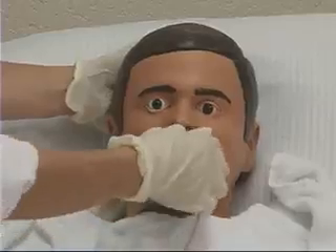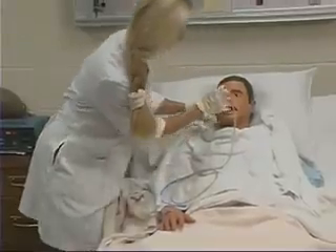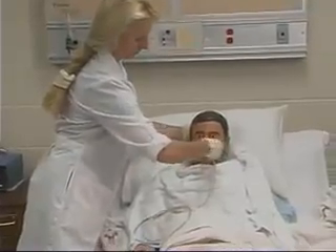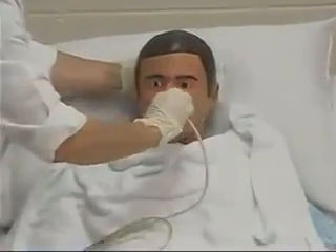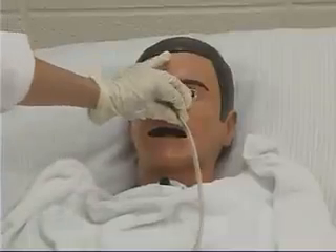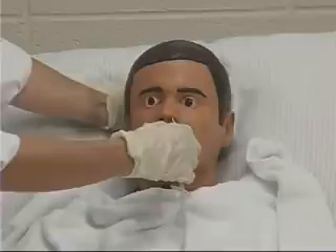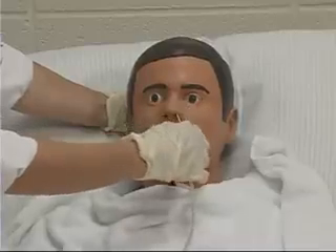Swallowing helps to open the upper esophageal sphincter and allows the tube to enter the esophagus. Once the tube is advanced toward the back of the throat, have the client flex the head forward, then rotate the tube 180 degrees inward toward the client's other nostril. This helps direct the tube past the nasopharynx. If the client gags, briefly stop the tube advancement.